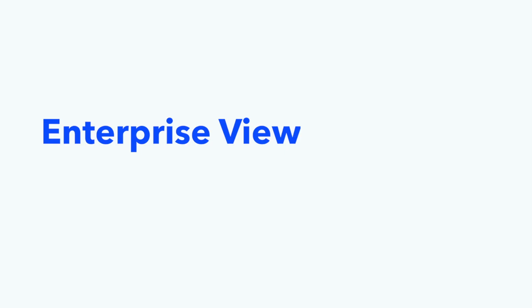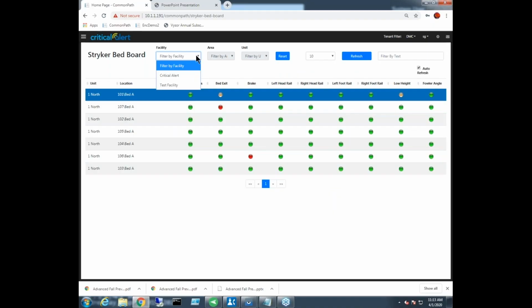So this will update. Again, it allows you to do it by facility, and by individual unit if you want to choose a different unit for review, and it will auto-update based on whatever setting you determine for that information. So it's a display application here.